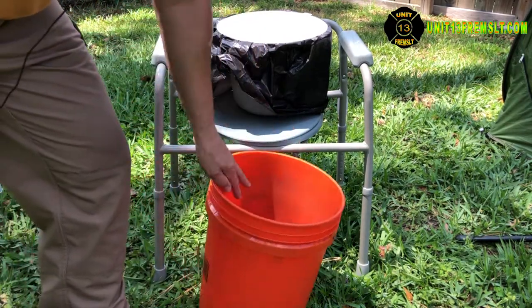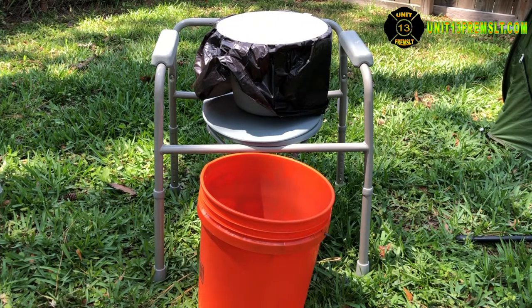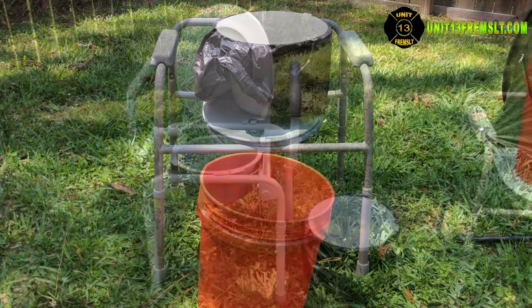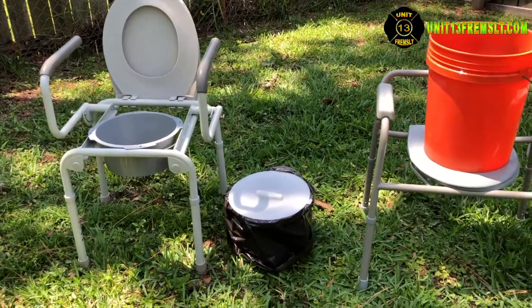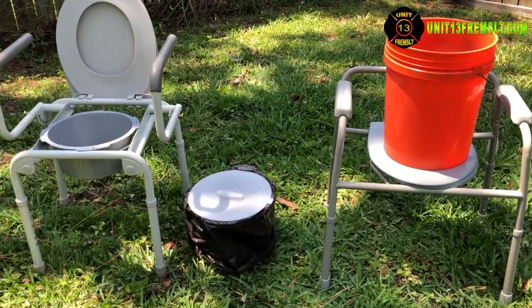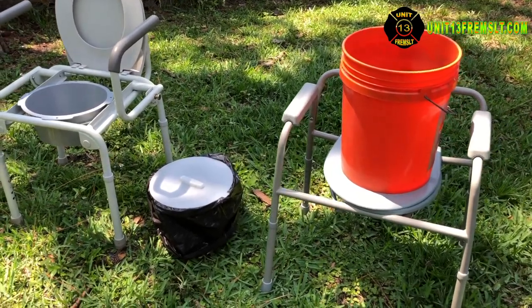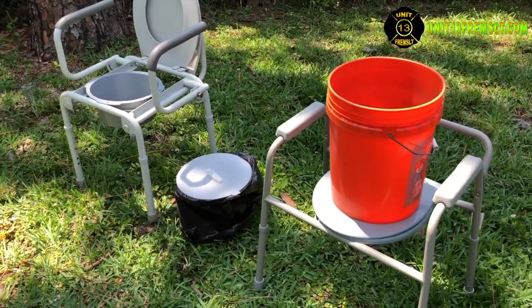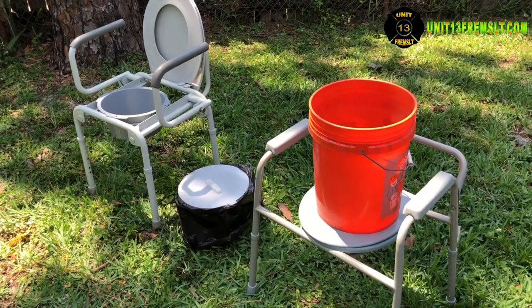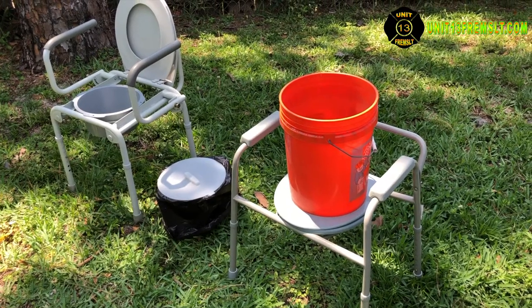Not long ago, one of our sewer mains broke here and we were unable to use our toilets or sinks. It was really handy to be able to take these commodes out of storage and bring them into the rooms where we would normally have toilets. It took less than 10 minutes to get them set up — really handy. I hadn't thought much about our sewer not working, but thank goodness we had these on hand, because it took three days before they could come out and fix it.